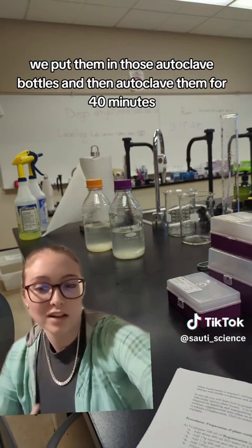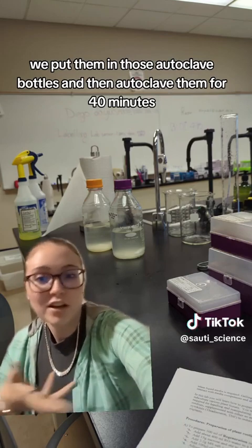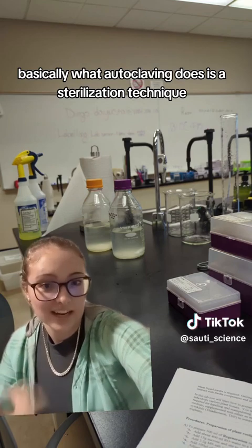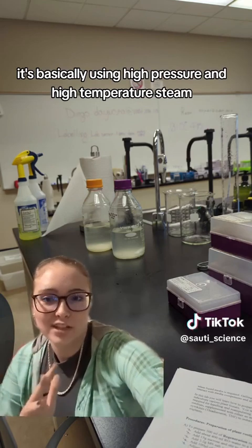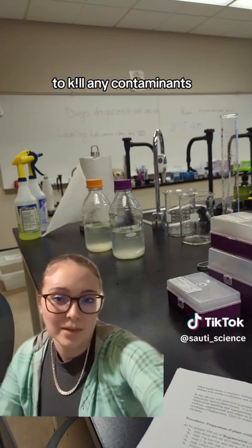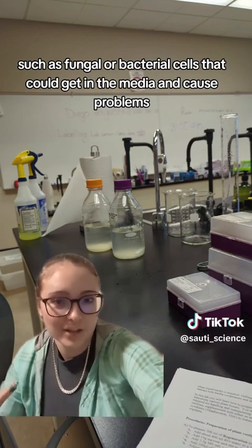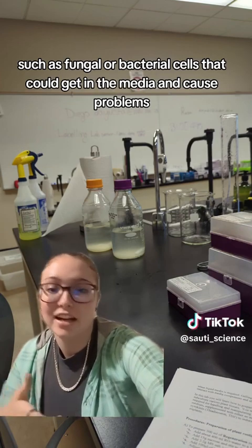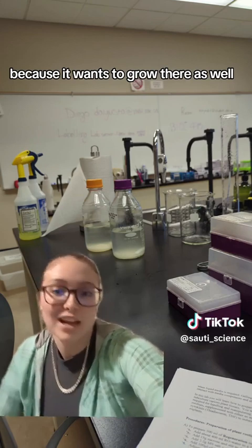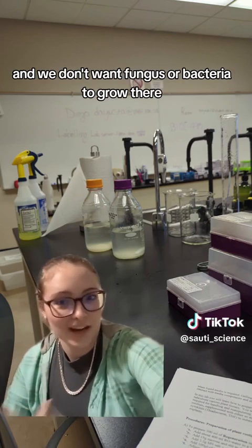Once all of the ingredients for the two different media were mixed up, we put them in autoclave bottles and autoclaved them for 40 minutes. Autoclaving is basically a sterilization technique using high pressure and high temperature steam to kill any contaminants, such as fungal or bacterial cells, that could get into the media and cause problems by growing there.